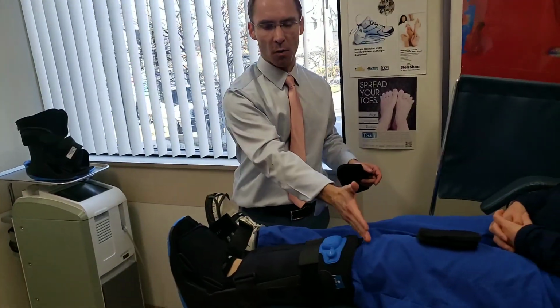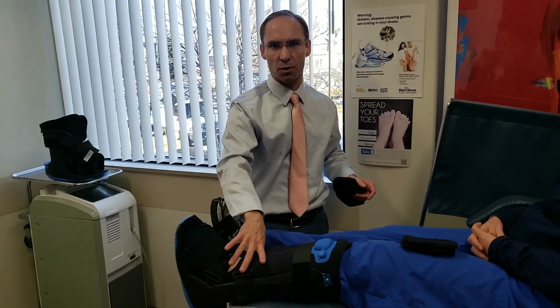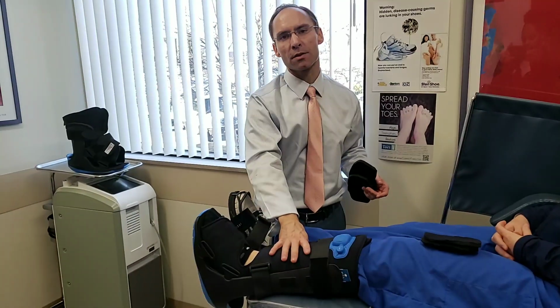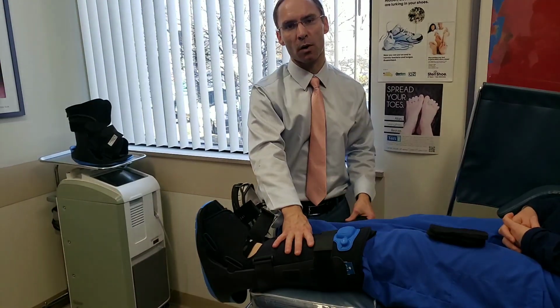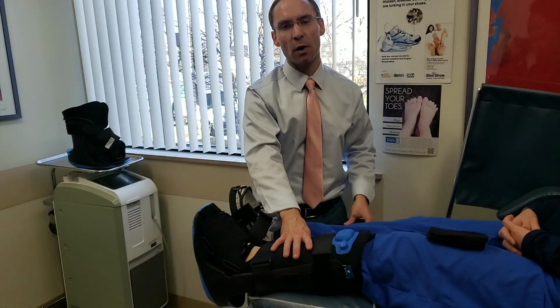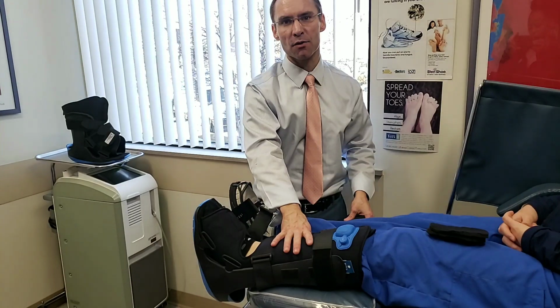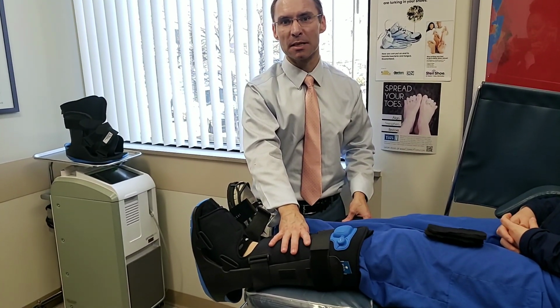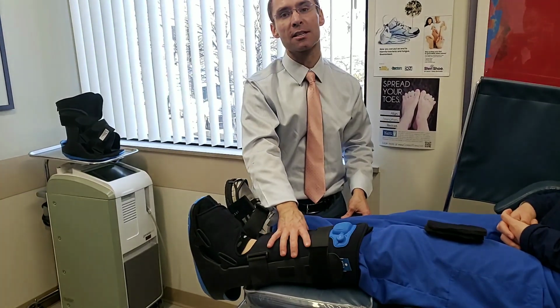So just to review, the tall one is used for different types of tendon issues or ankle issues that aren't getting better, that are very inflamed. How long do you wear this? Usually if you're going to find benefit, you're going to wear it maybe for a week or two. If what you're dealing with doesn't get better after a week or two, you should probably see your doctor to see if there's something else that needs to be done, some other type of treatment. You're not going to wear these long term.